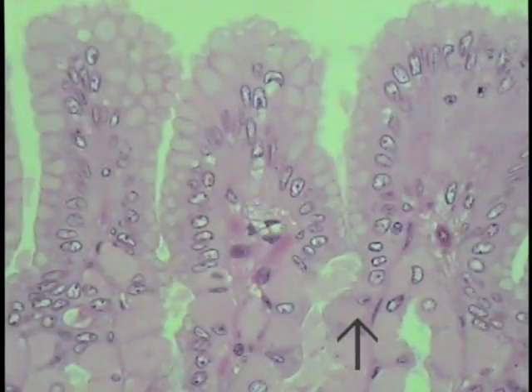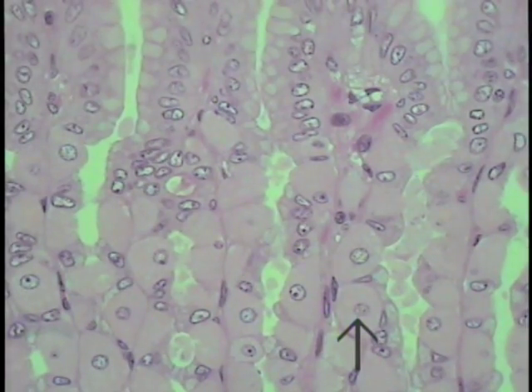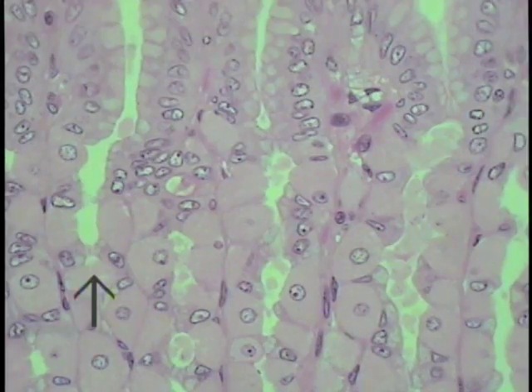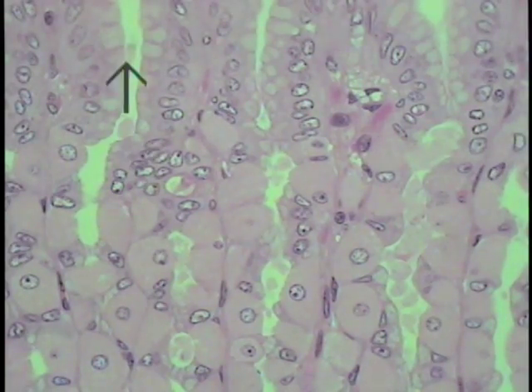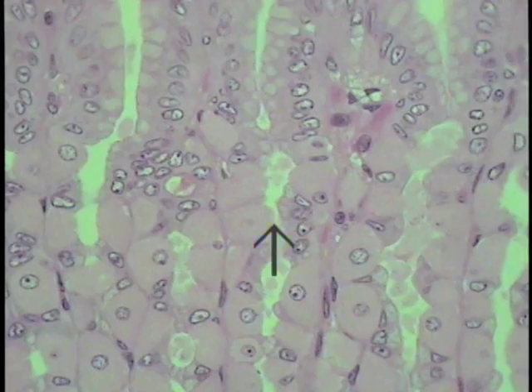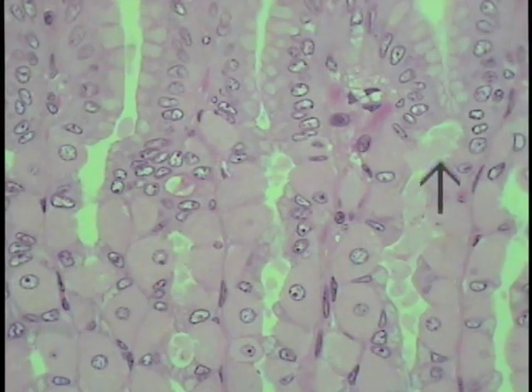This particular region shows the openings, or the continuity, of the tops of the oxyntic glands opening into the gastric pits, which is shown here. Another example of this phenomenon is shown here. The junction's right about at this level. This is the lumen, where the arrow is, of the oxyntic gland, very narrow and emptying into the base of that gastric pit. Another example is shown here.